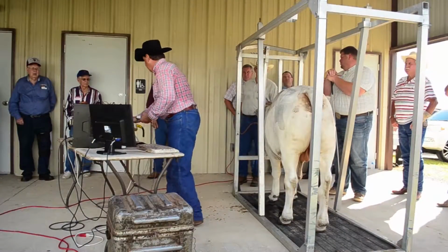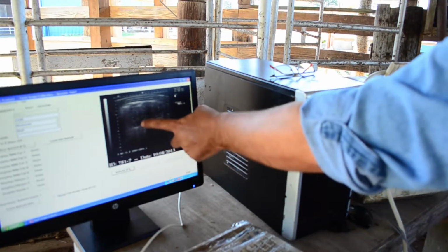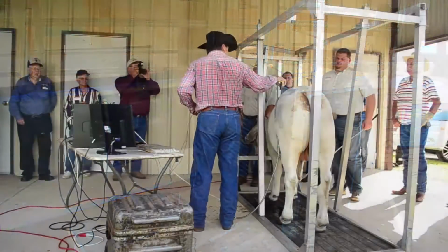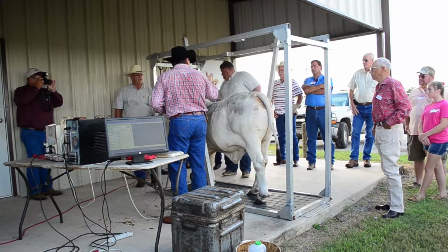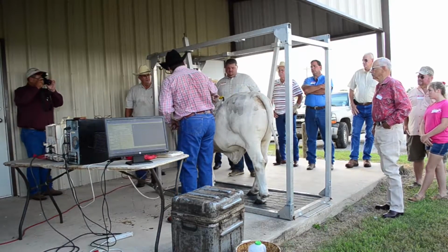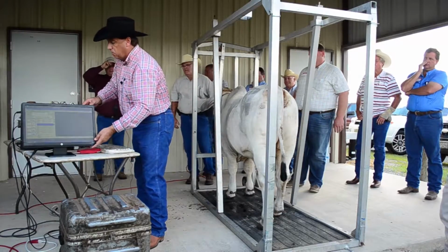Between number 12 and 13, that's where we get our ribeye image and our back fat measurement. And then we go to our marbling, IMF, intramuscular fat. We're going crossways right through the muscle. We shot through it for the ribeye, like cutting halfway through something. Now we're doing a horizontal image through here. The tops of the 3 ribs, the last 3 ribs in there, that's what we're looking for. The white inside that image is the intramuscular fat. That's what we're looking for in measuring marbling. Marbling score is a direct correlation to your quality grade in your cattle, your select, choice, and prime, and so forth.